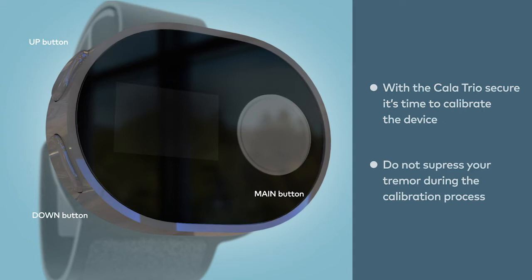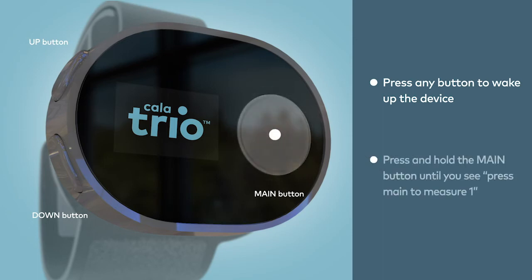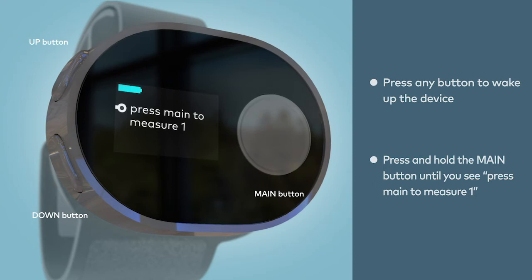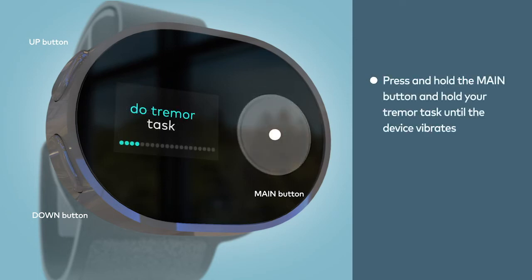We're now going to calibrate Calatrio. First, wake up the device by pressing any button until you see Calatrio on the display screen. From the Calatrio screen, press and hold the main button until you see 'Press Main to measure 1'. Next, assume your tremor task position. When you're ready, press the main button and hold your tremor task until the device vibrates, about 20 seconds.